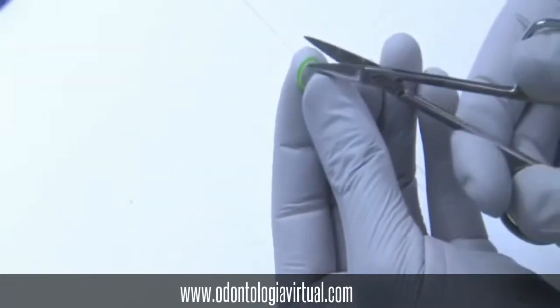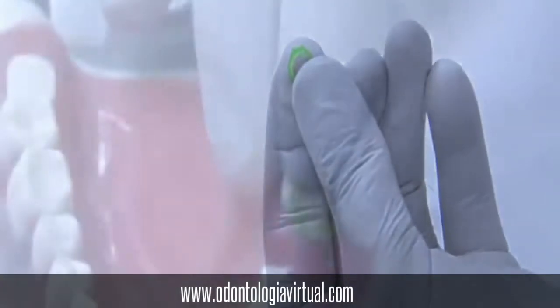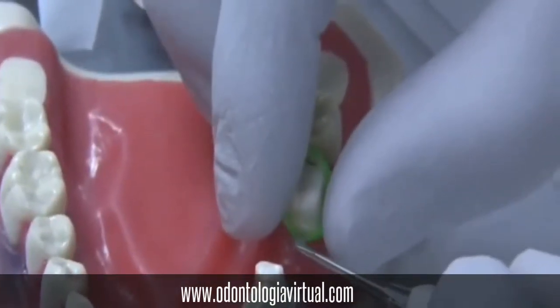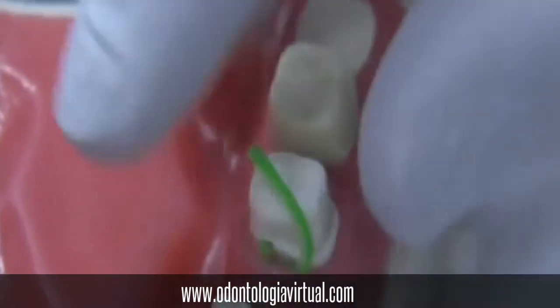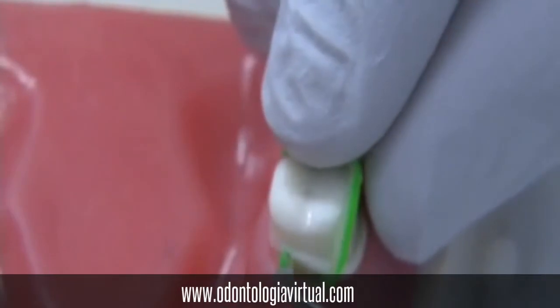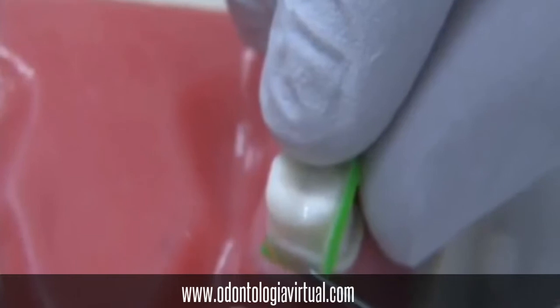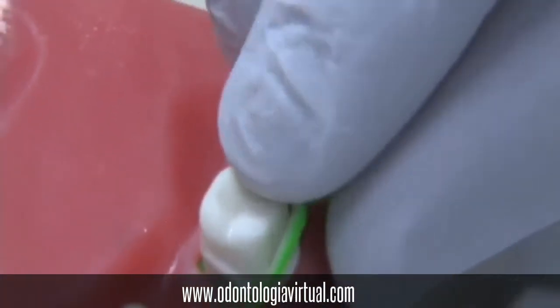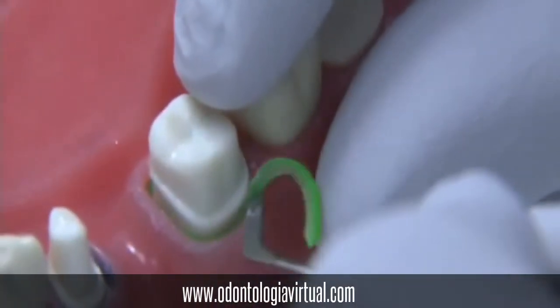You will cut those with a pair of scissors and we will use that as a retraction cord so that we can retract the soft tissue or the shroud that we have in our teeth. Use a plastic instrument and put that in between the teeth and the soft tissue. Slowly start with one end and place that retraction cord or rubber band in between the soft tissue and the tooth.